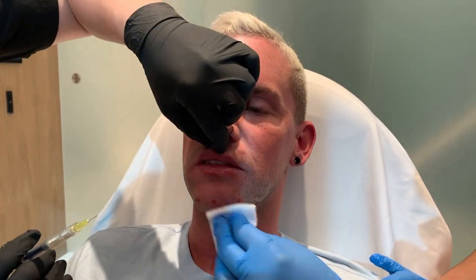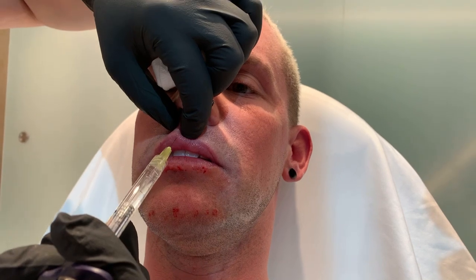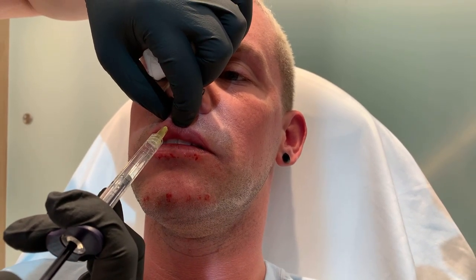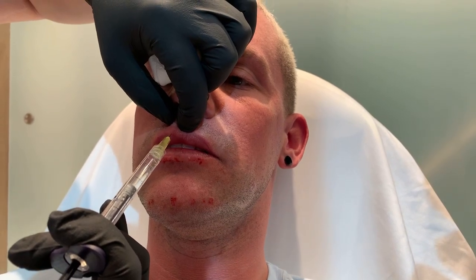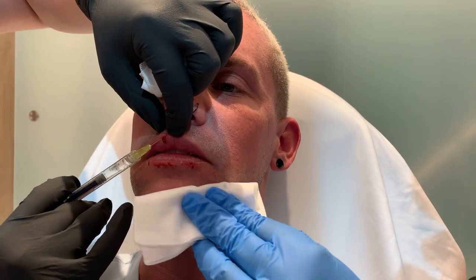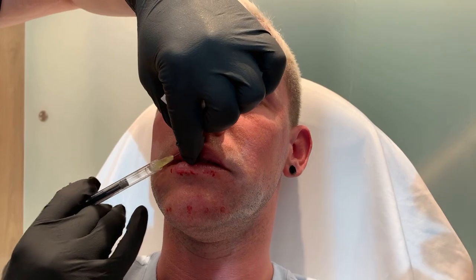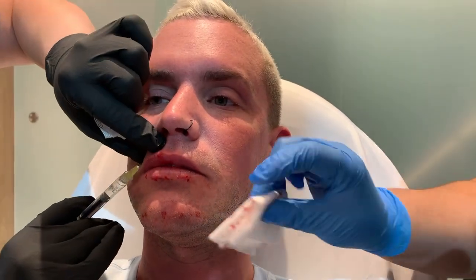So now let's focus on defining the upper. And actually, in men, we don't always do the pillar here, but we're gonna do that on him because it's gonna support the cupid's bow. So we're gonna define the pillar a little bit. And then I'm gonna go right into the edge of the cupid's bow. They said it feels like I'm the one in the chair.